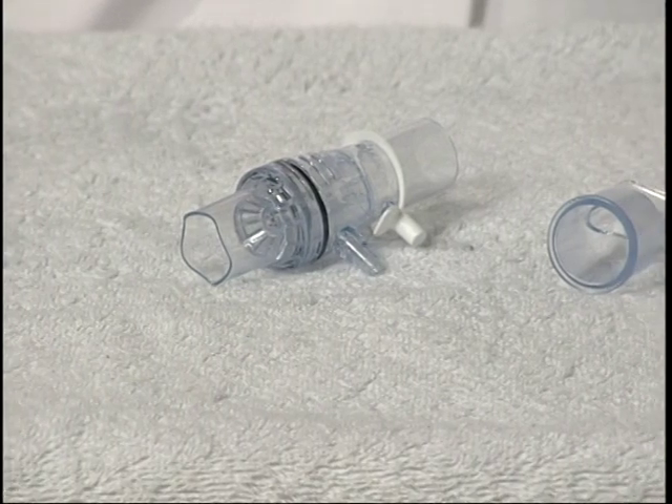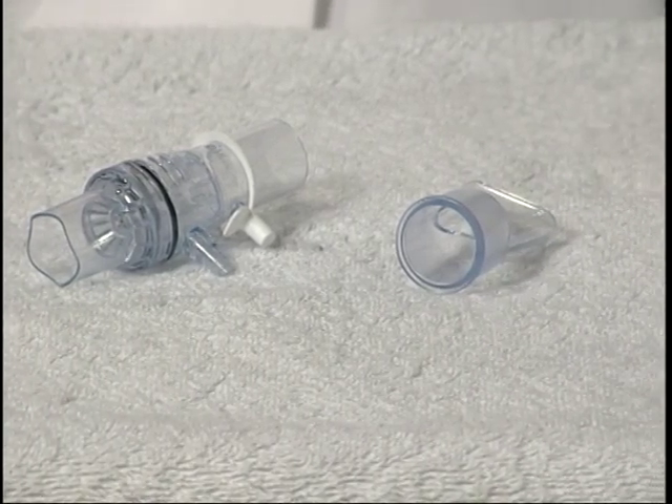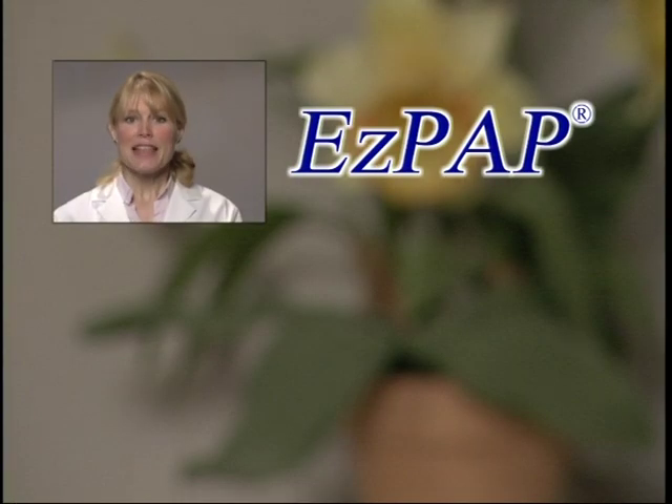EZ-PAP is intended for single patient use and should be cleaned as needed. Do not immerse it in liquid. Rather, wash the parts by swabbing them with warm, soapy water. Rinse and then air dry the device by resting it on its side with the mouthpiece removed until all liquid droplets have evaporated.